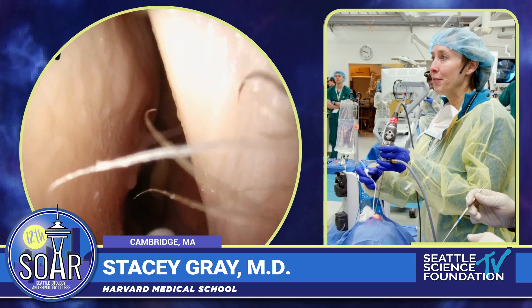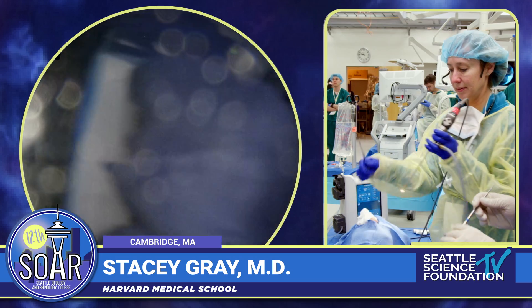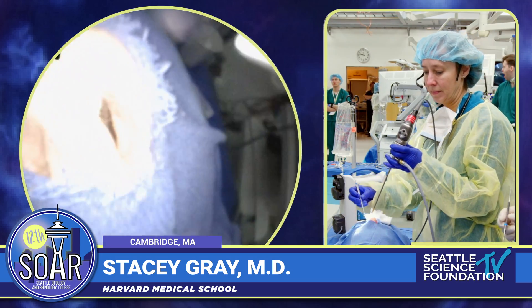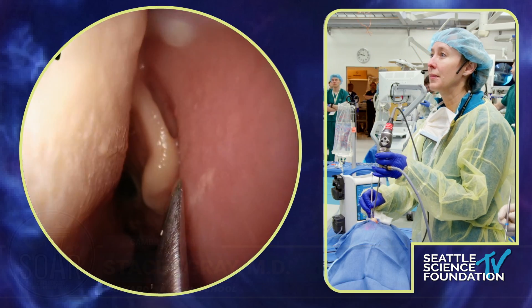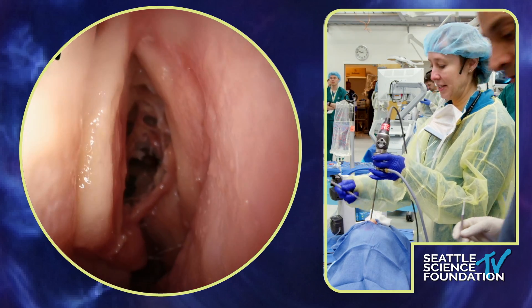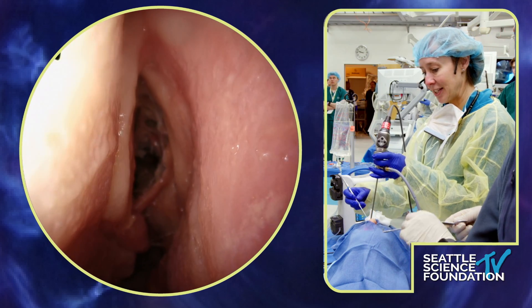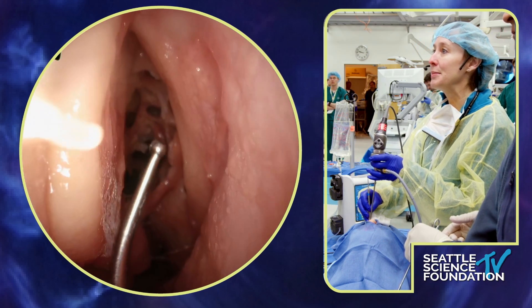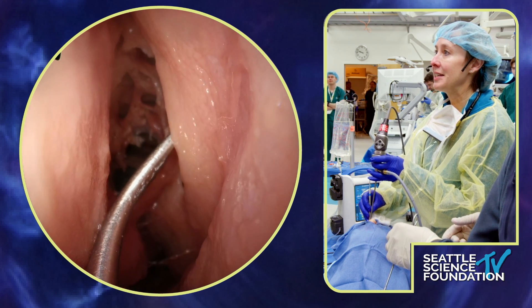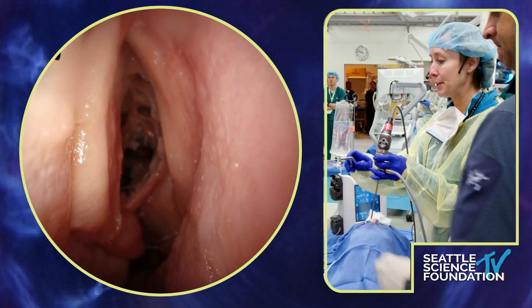We're going to focus on the maxillary now. Let's use a freer first to push that turbinate back over, and open up that space so we can see the ostium well. As we talked about on the panel yesterday, this ostium seeker is your friend to really sort of move that uncinate, but I don't like to destabilize it at all. I'm really just making sure that my backbiter can fit into that space.